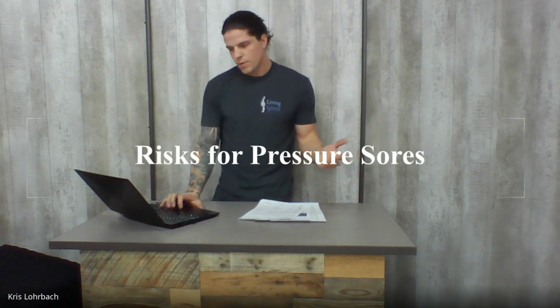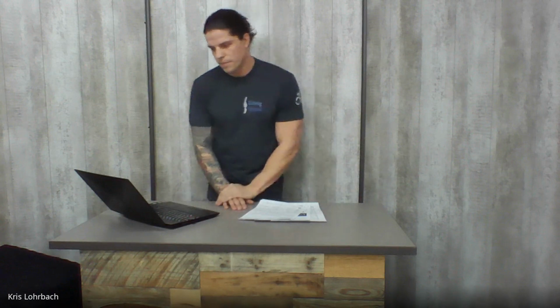You'll hear people say a lot, oh yeah, I've had a pressure ulcer. And immediately if you hear that, there are cushions you should consider and cushions you shouldn't consider. The risks of getting one: generally people who sit for more than 4 hours, so people in wheelchairs, inability to self-position, and people with impaired sensation. A lot of people with spinal paralysis don't have sensation in their legs, and if they start getting pressure, they can't feel it. So a lot of times they don't know until it's too late.